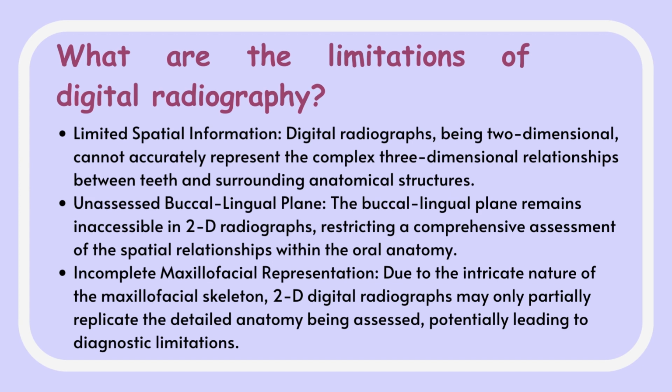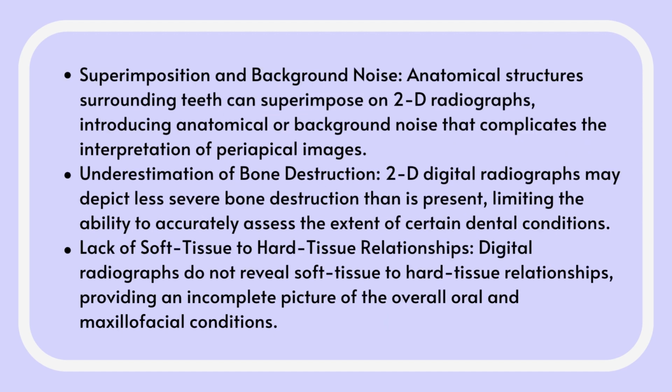Incomplete maxillofacial representation. Due to the intricate nature of the maxillofacial skeleton, 2D digital radiographs may only partially replicate the detailed anatomy being assessed, potentially leading to diagnostic limitation. Superimposition and background noise. Anatomical structures surrounding teeth can superimpose on 2D radiographs, introducing anatomical or background noise that complicates the interpretation of periapical images.